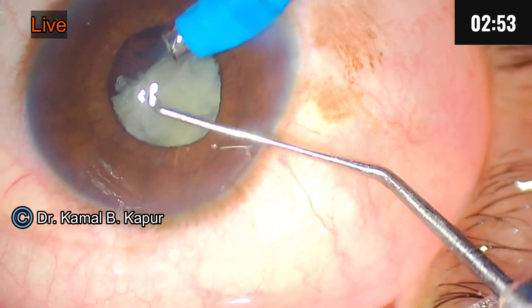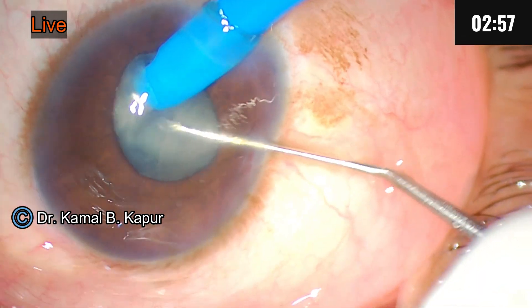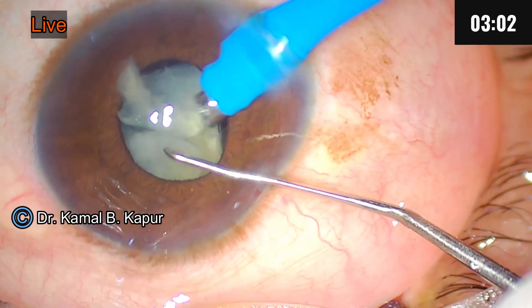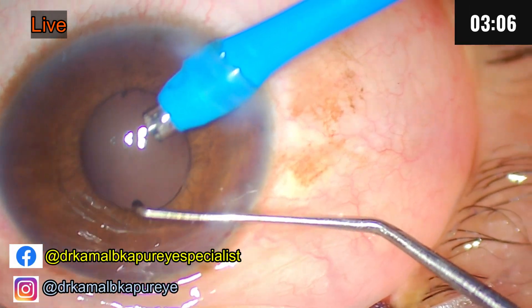You can see the pupil is not very well dilated, and even the effect of epinephrine/adrenaline is not very effective in this case.